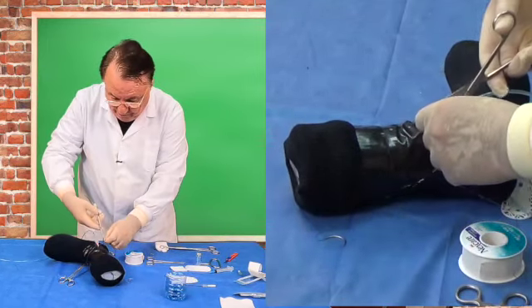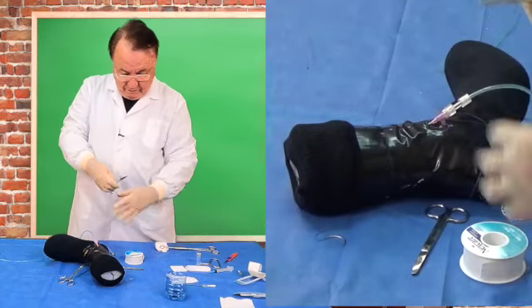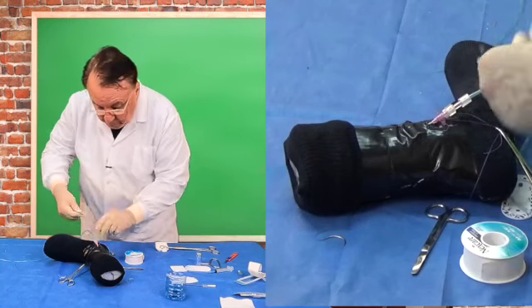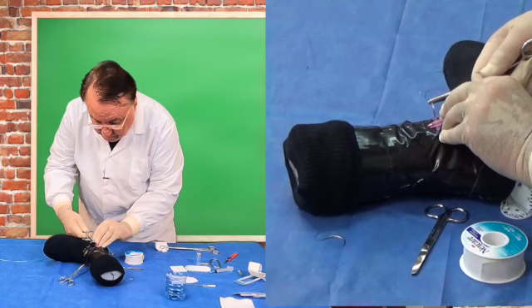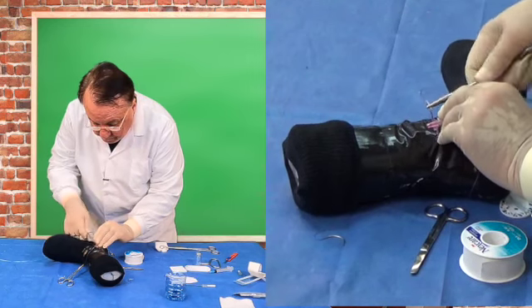It's not quite lying flat, there is another place to suture on the catheter on the other side. So I'll utilize that to get my IV laying down flat, which will assist in infusion.